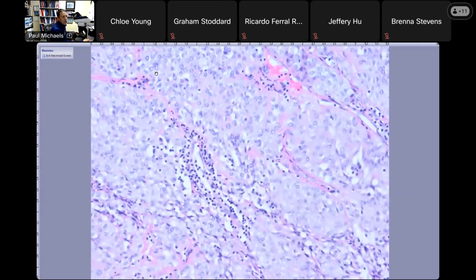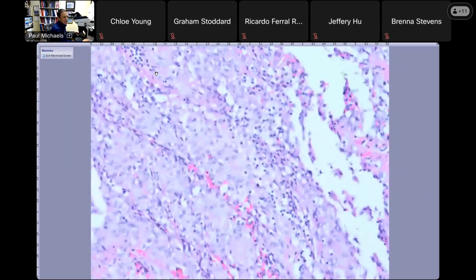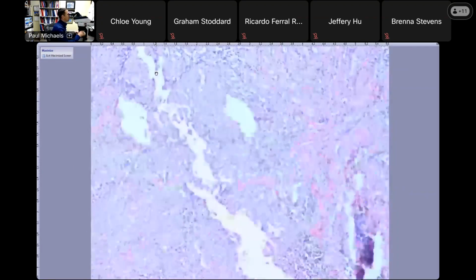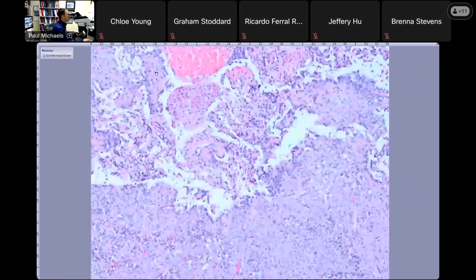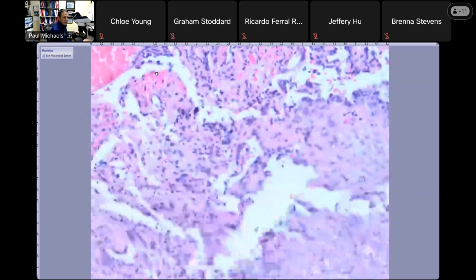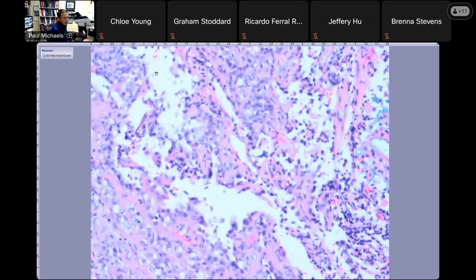This could be adrenal cortical. If it is, is this a carcinoma? It's kind of solid, but it's not mitotically active. There's some lymphocytes intermixed. It's somewhat vascular in areas. Here it's kind of falling apart, which I think when you look at it closer is vascular. Always think about renal cell, something like this. This doesn't really look like a renal cell. It could be. Here's some more of that vasculature with the separated cells in between.